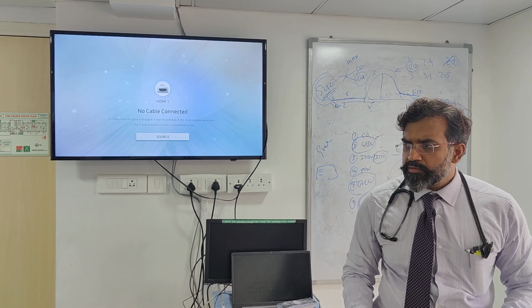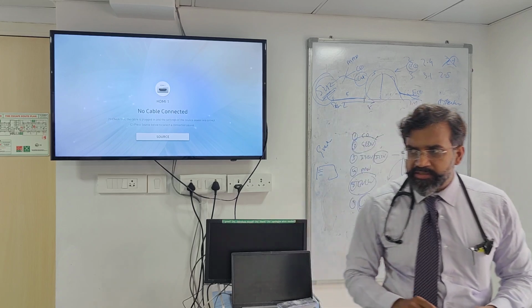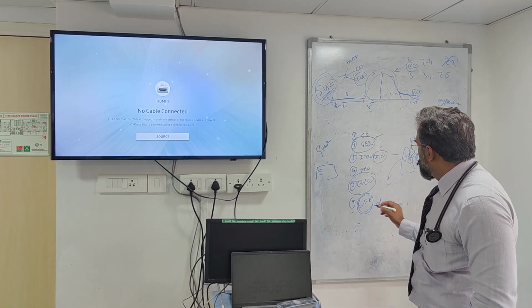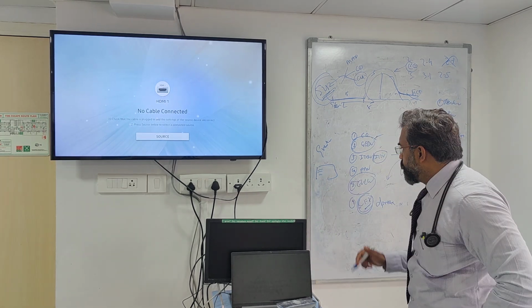In the calculation there will be something that comes as DP max. It is looking at DP max, which will actually give you the cardiac function index. The DP max is not supposed to be very good. So I'm just telling you in order.